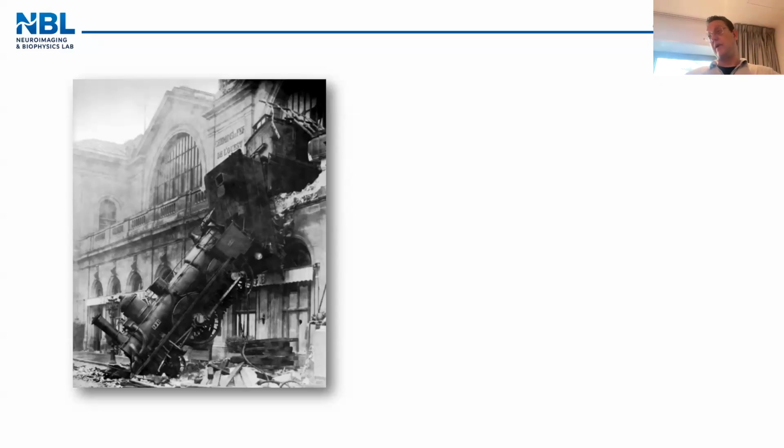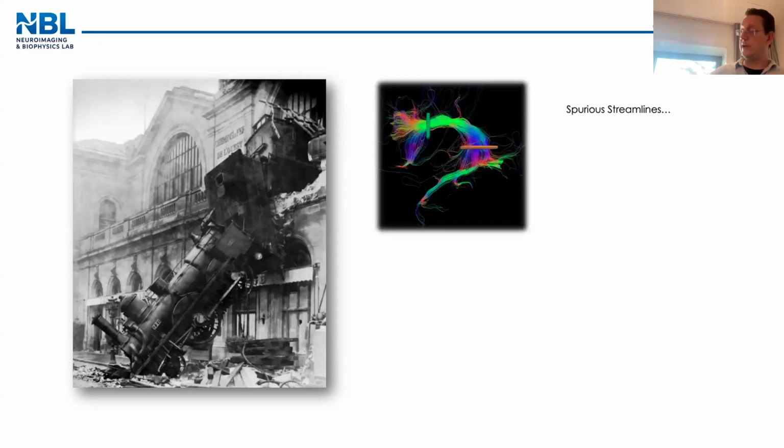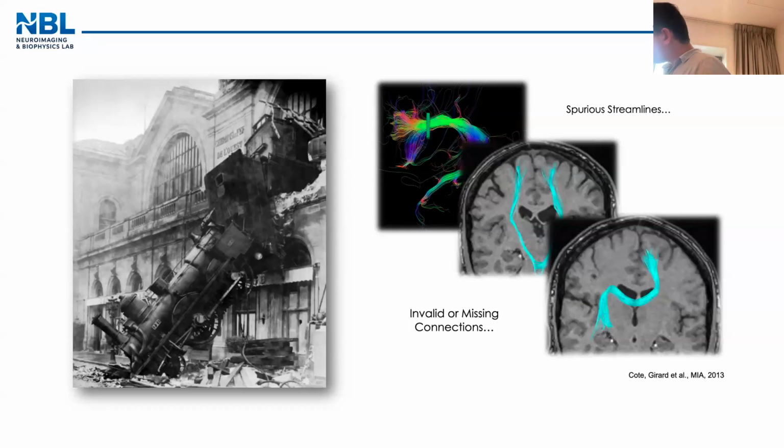Why? Because, as I said, remember, there are some limitations. For example, here in this case, if the data set is very noisy, I see the general shape, but I also see a lot of spurious streamlines around. Or you can see tracks that don't exist, like ponto-cortical, or even an S shape or something like that. These are tracks that don't look real if you know the anatomy, but they look like tracks, and clearly anatomically they are not. We know they don't exist.